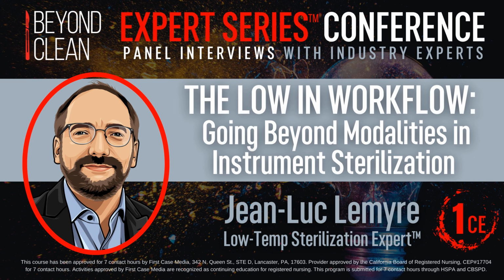That's really interesting. And I see where you're coming from with that statement, because as it stands, hydrogen peroxide, when compared to steam on a per cycle basis, I would imagine is a little bit more expensive, even with that smaller chamber. Because with steam, once you've invested in the infrastructure for it, it's not that much more expensive to run a cycle. But if you're constantly buying more sterilant for your hydrogen peroxide sterilizer, it would probably be wasteful to buy the amount to sterilize this huge chamber if you only had two cameras to put in there. So I can see that.